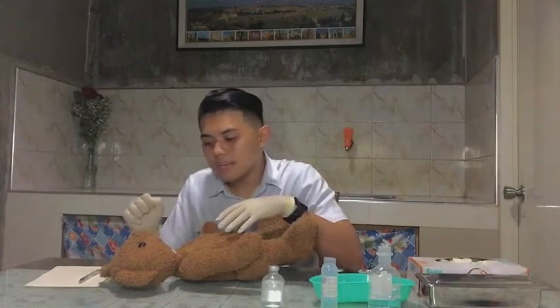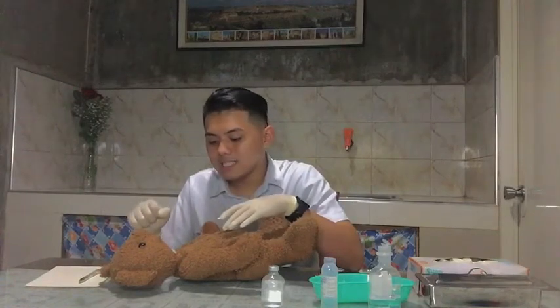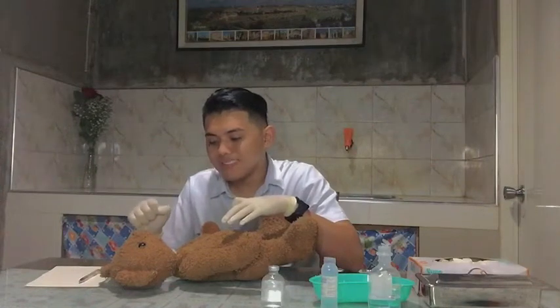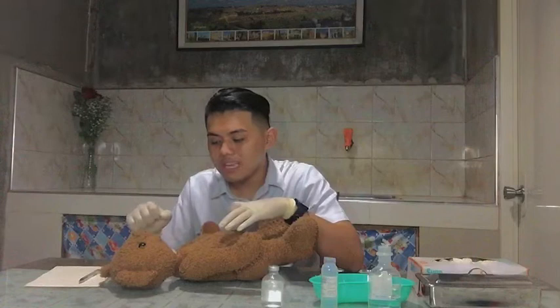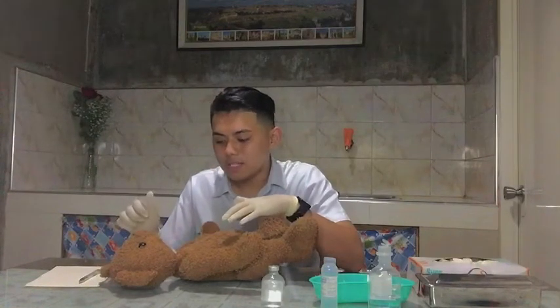Hello ma'am, I will be inserting subcutaneous medication for you. This is for your health, ma'am, and I want you to be informed that you may feel some pain afterward or see some redness here, but you have nothing to worry about. These are the indications that the medication is taking effect. Do you have any other questions so far? Okay, thank you for that.